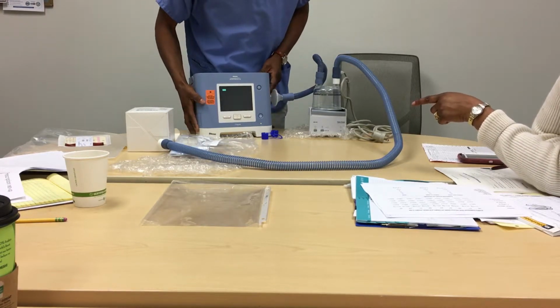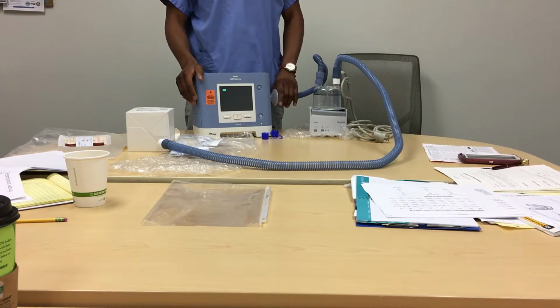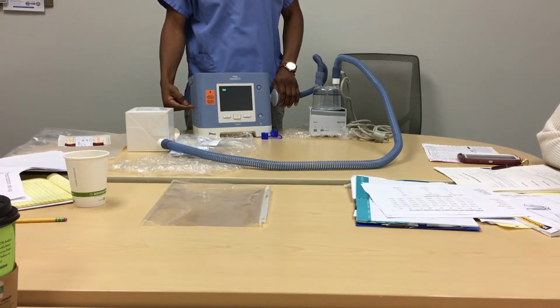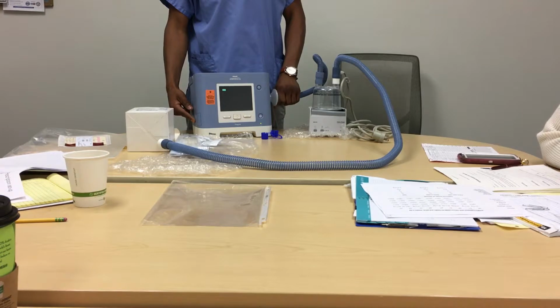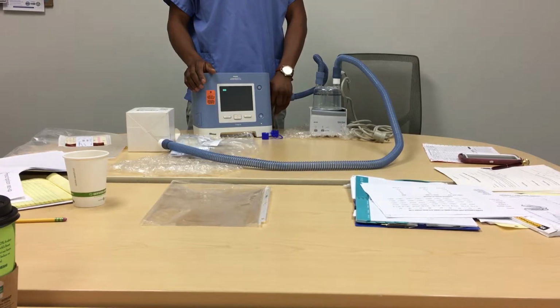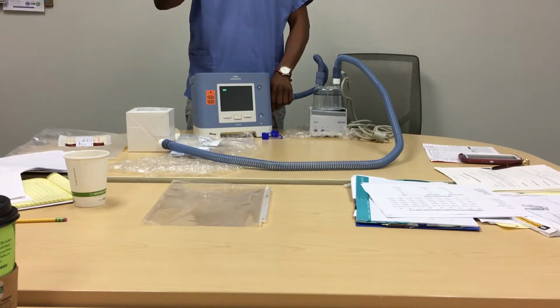They say that there's a Bluetooth, so what's the Bluetooth? I've tried to play with it a little bit. It will need a separate device to connect to. Like a modem? Correct. Or an app for your phone? Not the app, I tried it. It didn't work. We definitely need that modem. So it's pretty much SD dependent if you wanna do a download. Exactly. So, in my opinion, again, I prefer going out there because you see exactly what they are doing.